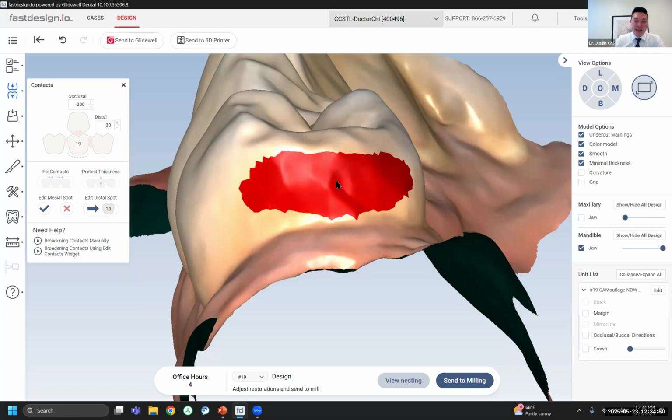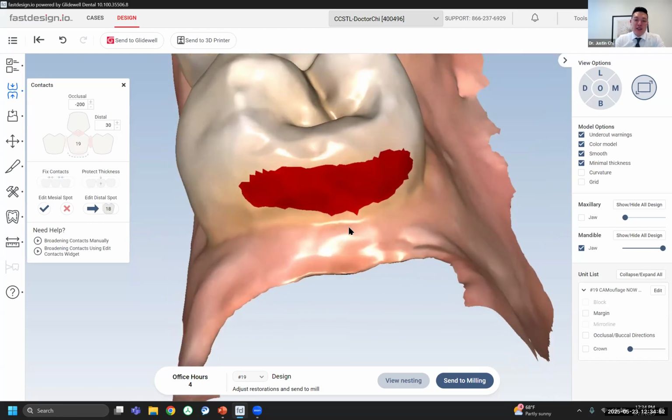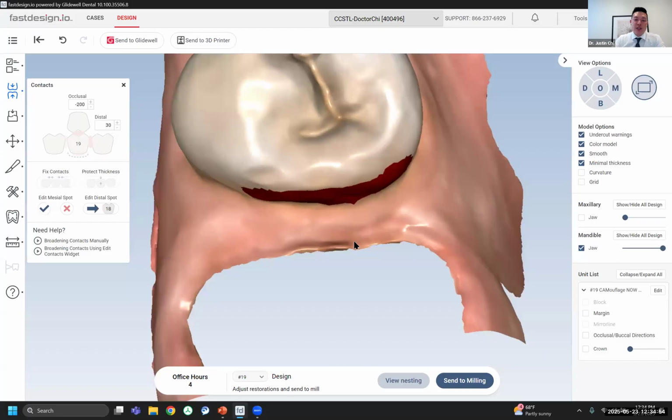your drawn contact area. Now, if we look at it from the top, you're going to now see how this painted area starts to wrap around that neighboring tooth. And that's not what we want. Natural teeth will just butt up against the adjacent teeth. And typically the contact area is not very, very large. So I know we all love broad contacts. I'll show you how we can get the broadest contact that is both hygienic and should also serve as a good way to minimize any food traps.